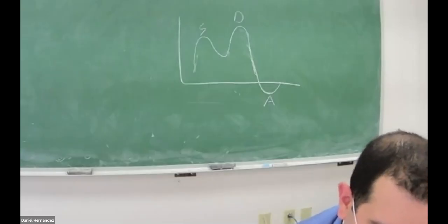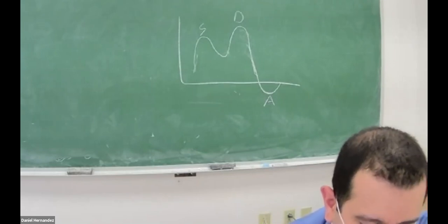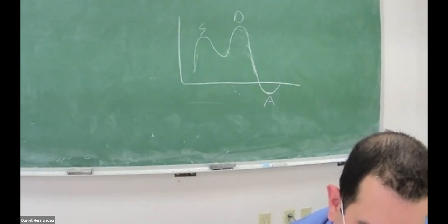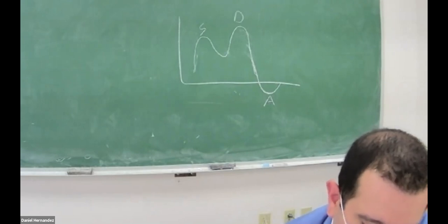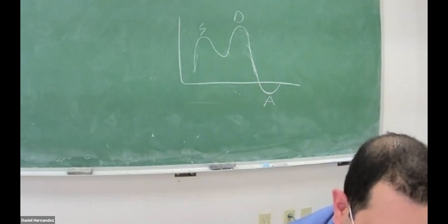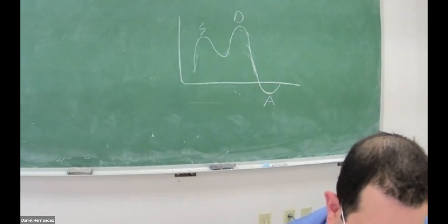What's one of the first findings that we'll see with aortic regurgitation?